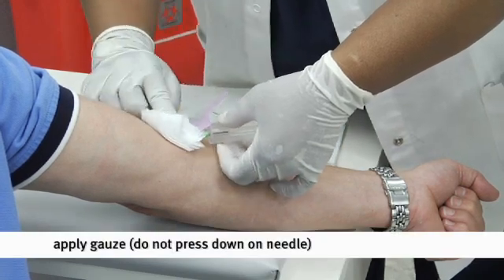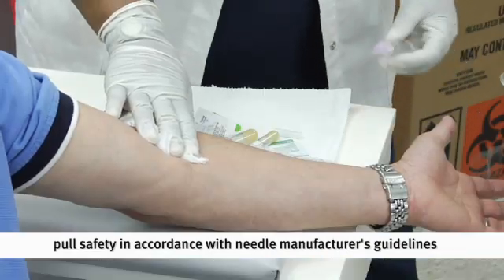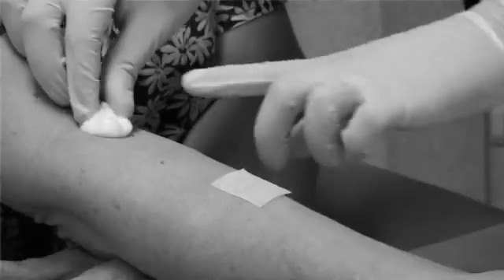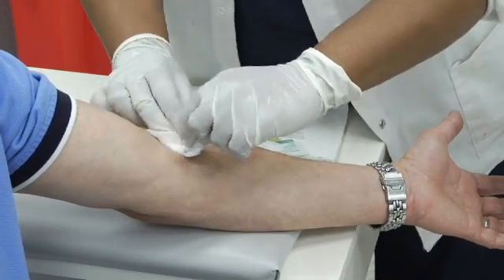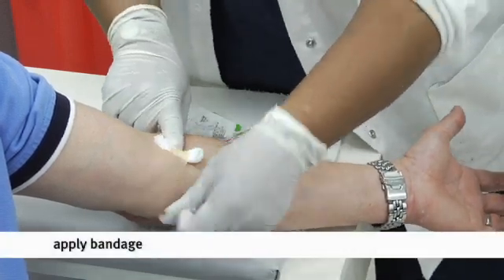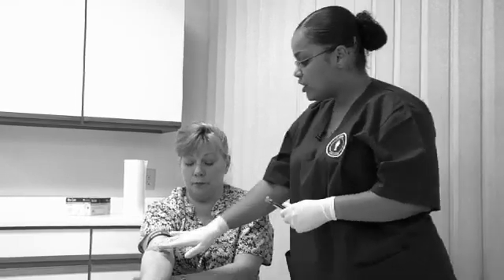Grab your gauze pad. Don't press down on the needle — remove it first, then apply pressure. Release the patient's fist. Pull your safety cap up so that you don't accidentally stick yourself. Toss it into your sharps container. Make sure that your patient has stopped bleeding by applying pressure around the site where you completed your venipuncture. Now apply a bandage onto the site. Instruct your patient not to lift anything heavy for at least half an hour to an hour. Do not do frequent bending of the arm because bending causes bruising. If the patient uses the arm strenuously within that time, there is a strong possibility they can actually start bleeding out.